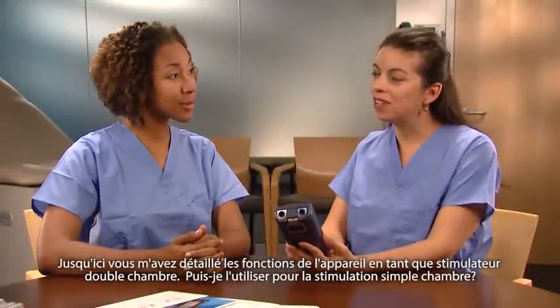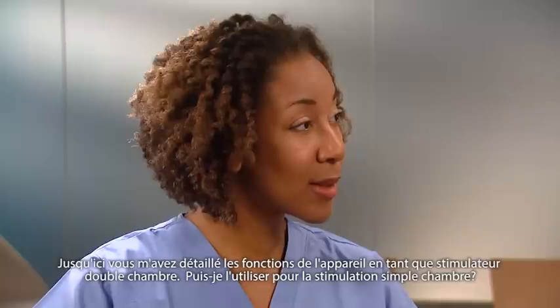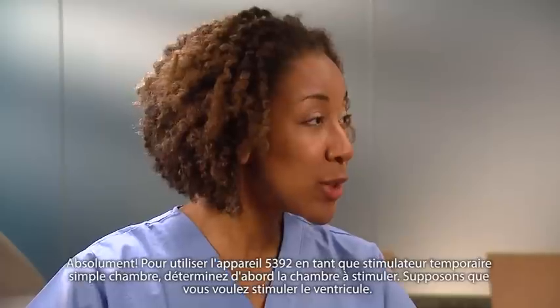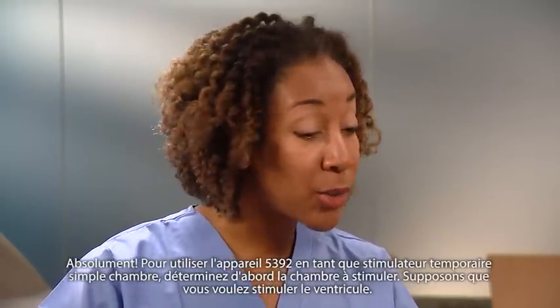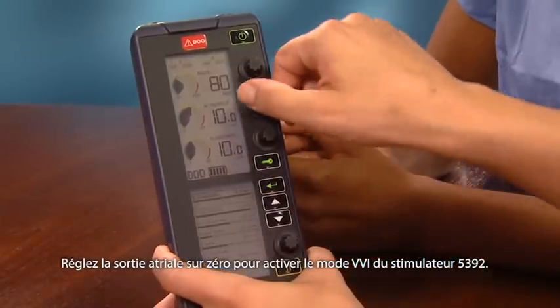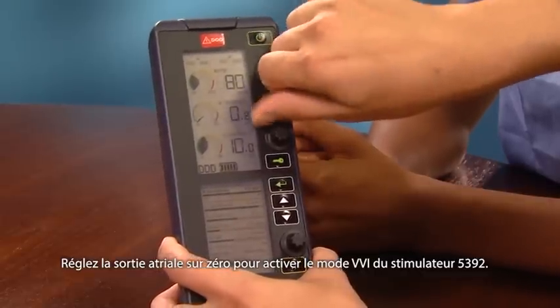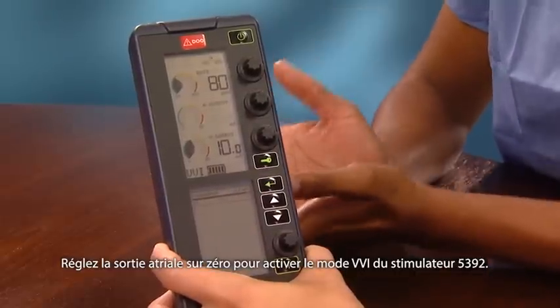So far you've shown me how the device functions as a dual chamber pacemaker. Can I use it to pace in a single chamber mode? Absolutely. To use the 5392 as a single chamber temporary pacemaker, first determine which chamber to pace. For example, if you want to pace the ventricle, just turn the atrial output to 0, and the 5392 will be in the VVI mode.